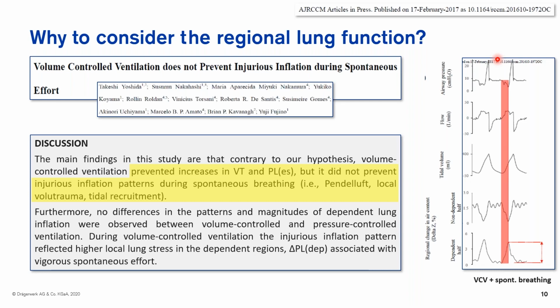And I think it's quite an interesting observation, because when we talk about mechanical ventilation, especially in the adult ventilation world, we do tend to use the volume control modes more frequently, because we can control the tidal volume delivery, and as a result the minute ventilation and the CO2 washout. And we would use lung protective ventilation strategies of 4 to 6 milliliters per kilogram of body weight. However, especially in spontaneously breathing patients, we would still see localized volume traumas.